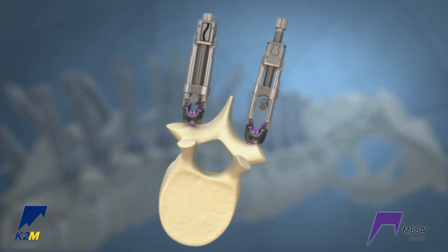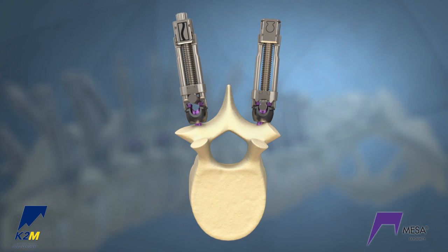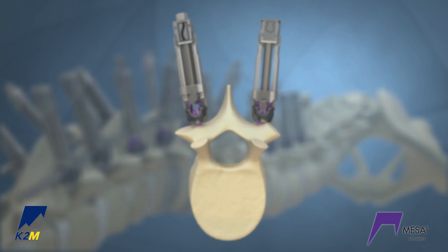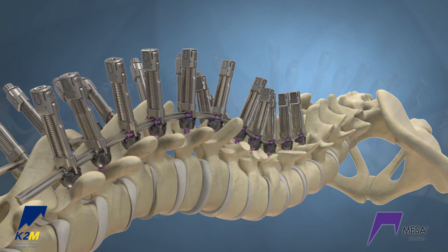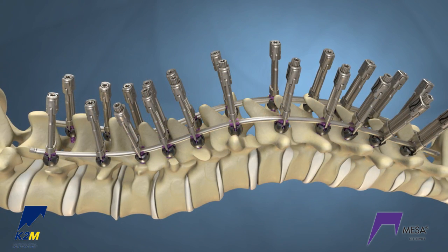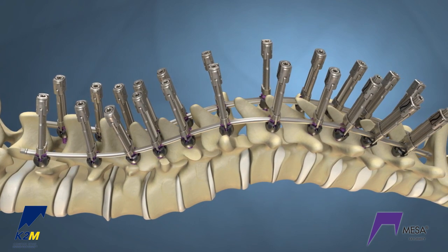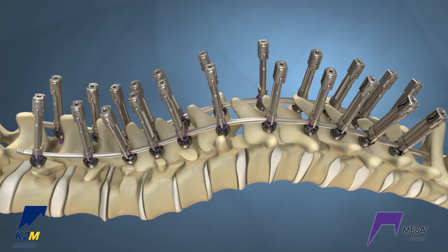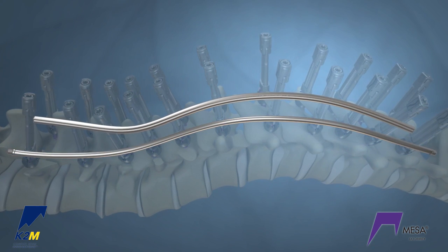Note the vertebral bodies rotating around the axis of the convex rod as the concave crickets are reduced. Continue reducing until all the concave crickets are fully reduced. This sequence also bows the convex rod. Complete the reduction by fully tightening the convex crickets starting from the distal end of the construct. Note, at this point the rod and rail are nearly identical in contour.